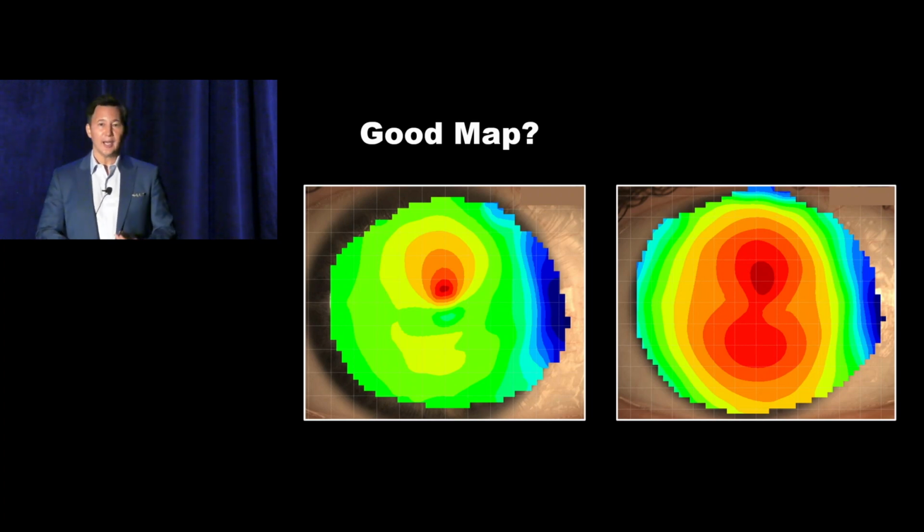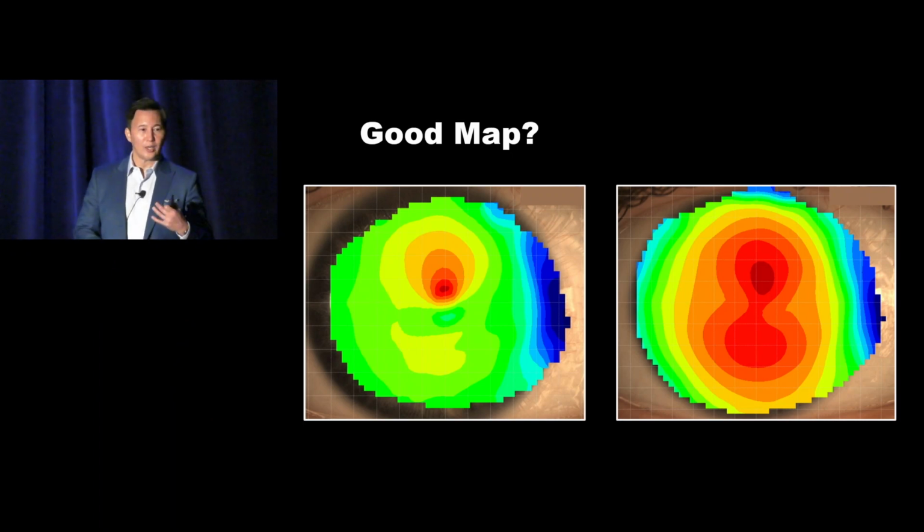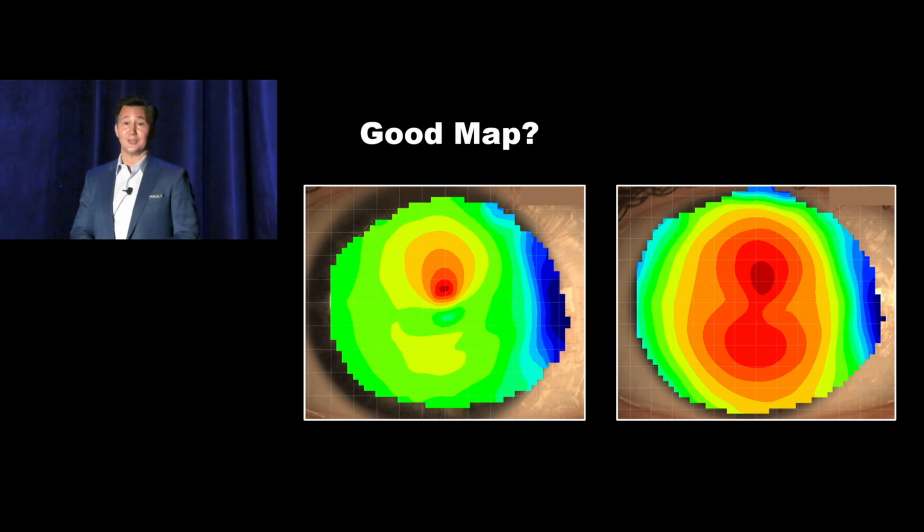So you can see how much topography can lie to you. It constantly needs to be assessed for whether it's cheating. It's just a dirty, rotten scoundrel when it comes to topography capture. So just be super critical. Take multiple maps. That's how you can tell, is one possibly false?